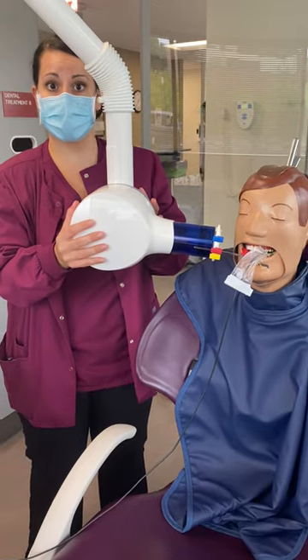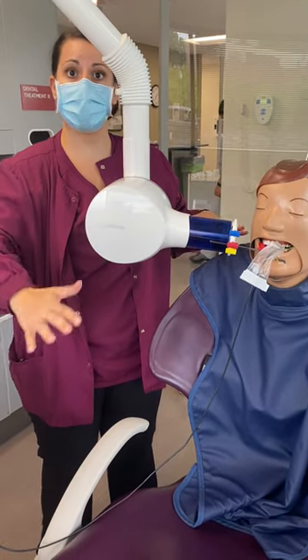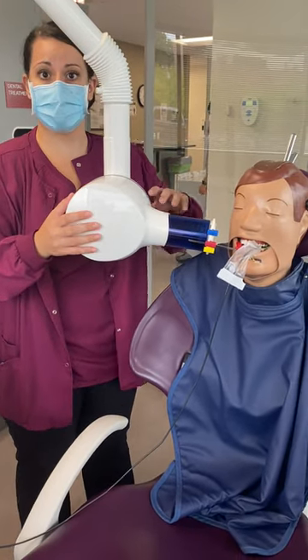This is going to be the same thing on the left side. However, like I said, you still have to remain standing on the right side of your patient.